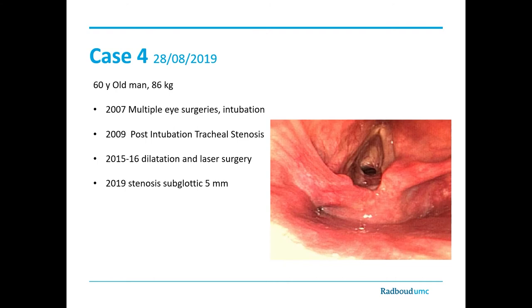We would like to share with you in more detail the fourth case of tracheal surgery where we used Tritube. Partially successful, but it is a case that taught us a lot about the use of Tritube during these types of surgery. The case was a 60-year-old man. He probably got post-intubation tracheal stenosis following multiple eye surgeries he had in the past. He was treated by laser. And he had a stenosis with only a 5 millimeter lumen.